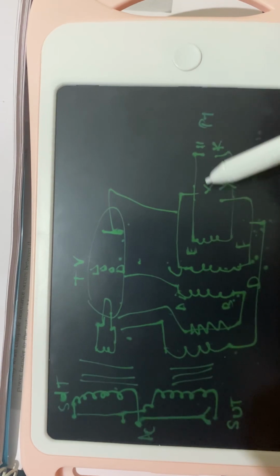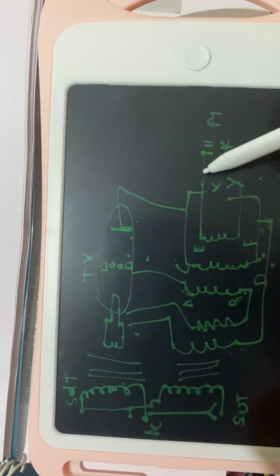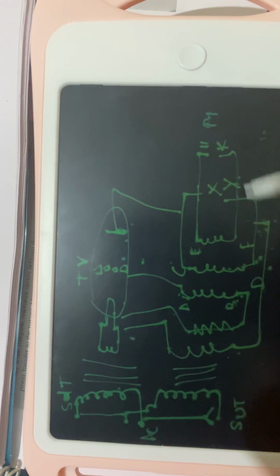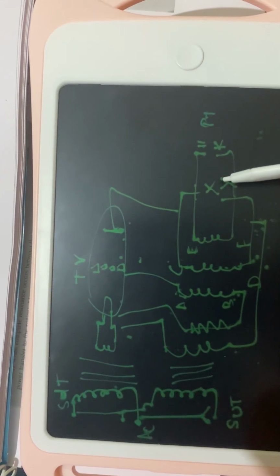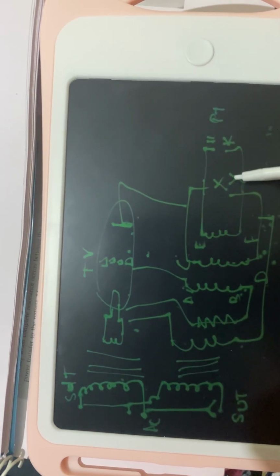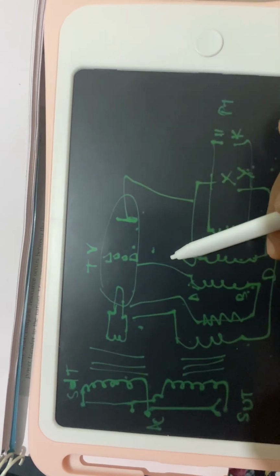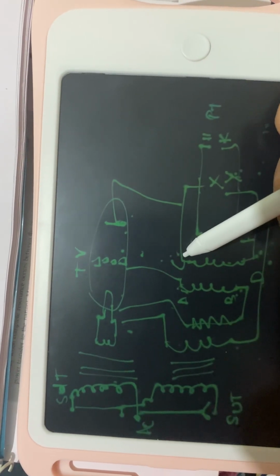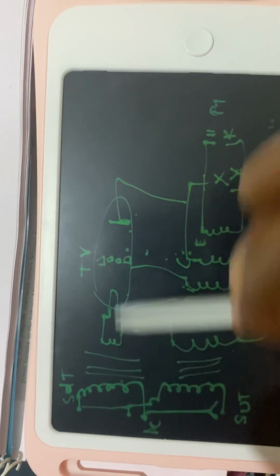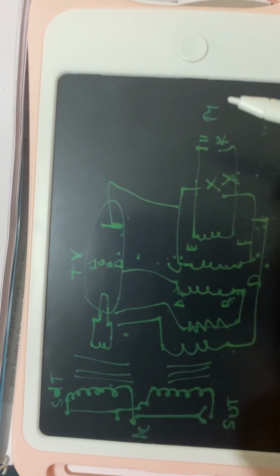The self-induced EMF will cause charging of the condenser XY. This is the condenser in the oscillator circuit. So this will be charged. Then, when this self-induced EMF drops, the charged condenser discharges. So the current again flows in this direction, through CD. When current flows through CD, there is an induced EMF in the AB direction. So again the grid is made negative, so again current flows. The same cycle continues, the charging and discharging of the condenser.